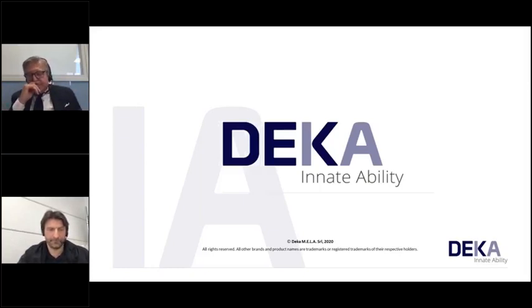But if you can, please use an interval between the two applications. So first Onda, because Onda needs 2 months to metabolize the fat that we remove, the stubborn fat in the subcutaneous tissue.